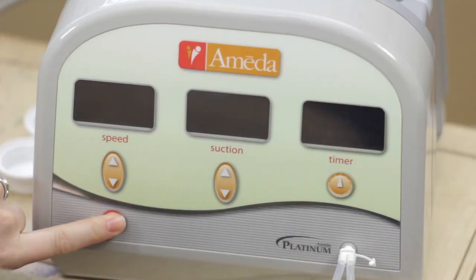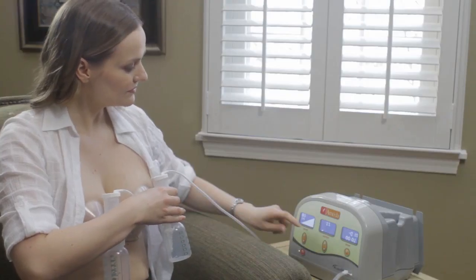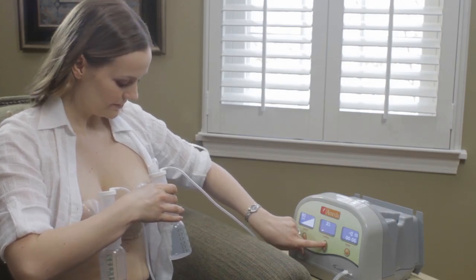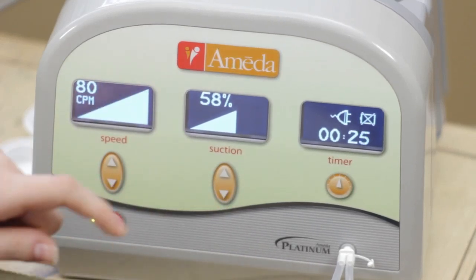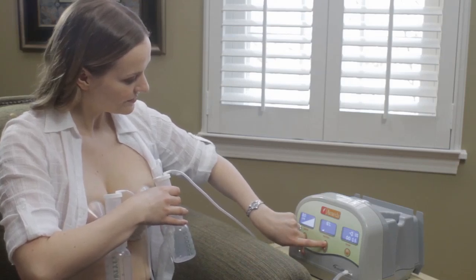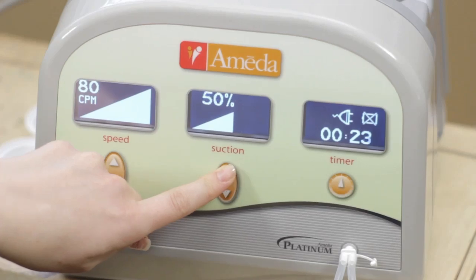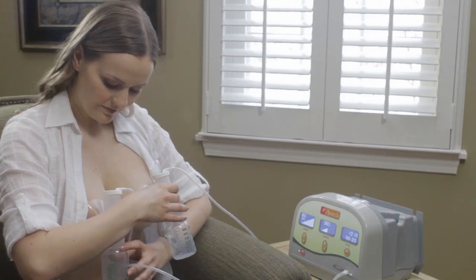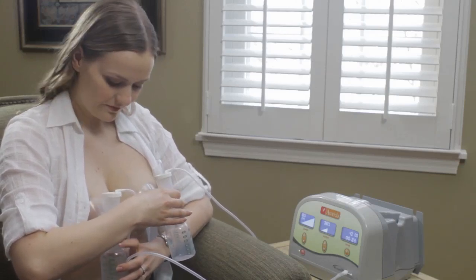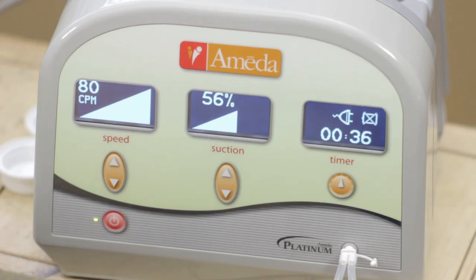Start your Ameda Platinum Breast Pump by pressing the power button. The pump starts at the lowest suction setting. Push the up arrow of the suction button until it feels slightly uncomfortable, and then turn it down a little until you reach your highest, comfortable level. Pressing and holding the button will increase suction by units of 10. Pressing and releasing the button will increase suction by units of 1. Use the highest suction setting that feels completely comfortable to you. If you feel discomfort during or after pumping, use a lower suction setting. The Ameda Platinum is the only breast pump with VacuSense technology that internally monitors the pump suction so it matches the level you choose.